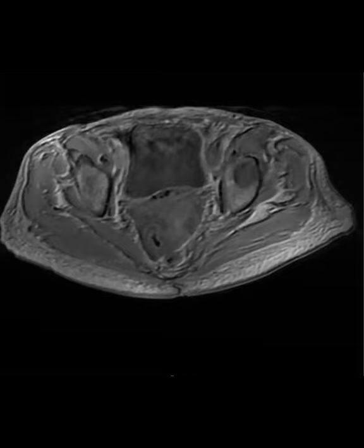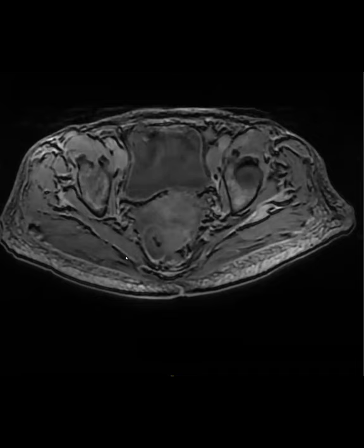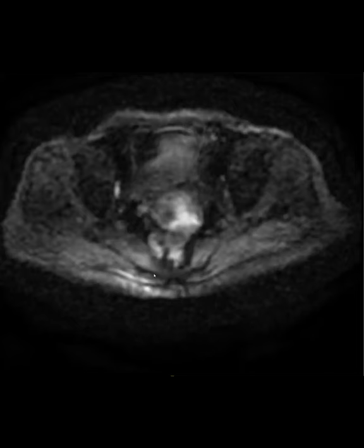So this is the in phase and then out of phase. Okay, guess not. Did you show the DWI? Sure, I can. So I guess it's this right here. Restricting, no? Do you have the ADC? Yeah, this was done at our satellite place. The quality is not always great. I guess they didn't give us an ADC. That would have been helpful. Sorry, I don't think they sent us an ADC for this, but I'll ask for it. Cookie's not worried about it.